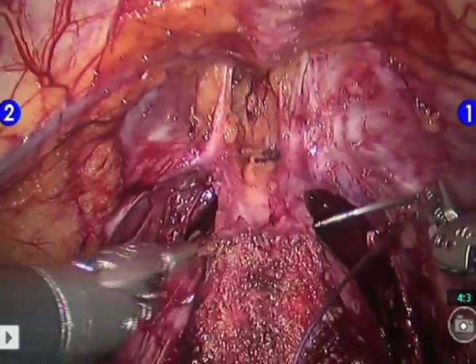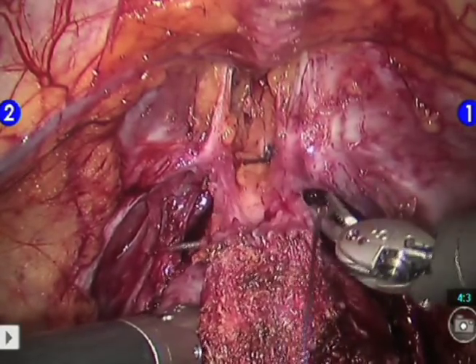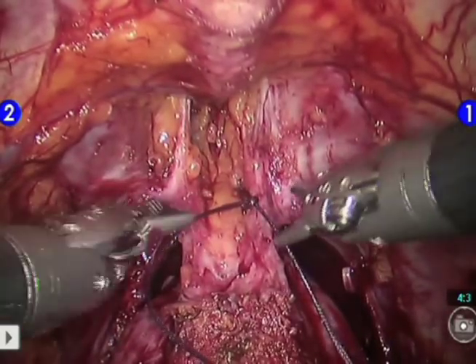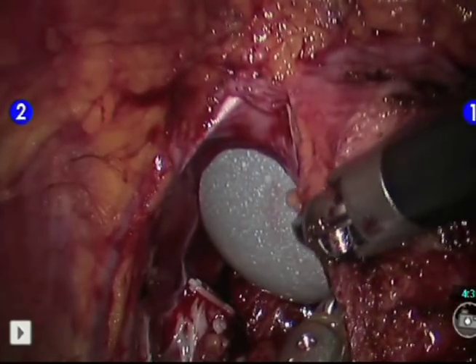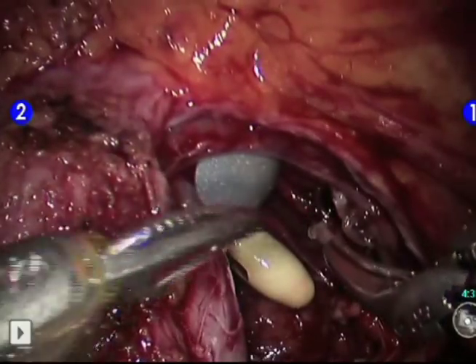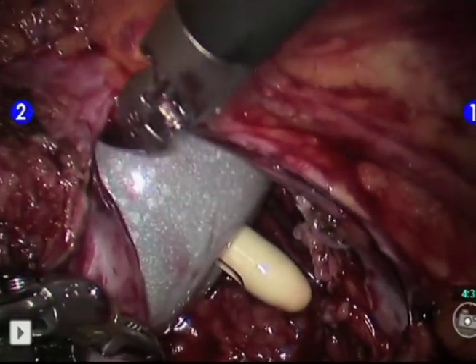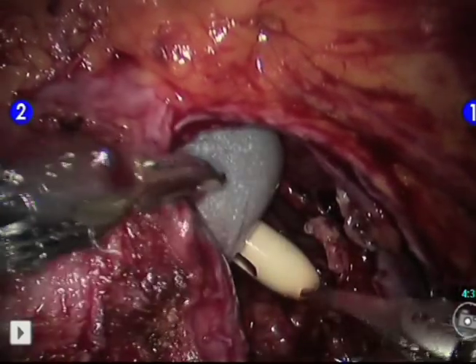Management of the DVC now depends on the width and thickness of the anterior tissue. If it is broad and thick, a DVC stitch with a CT1 needle and an 0-polyglactin suture is utilized, and the tissue is clenched using a slipknot. Alternatively, if the remaining tissue is thin, the pneumoperitoneum is increased and a Foley catheter balloon is inflated to 20-30 cc behind the prostate. The Foley is placed on traction, which partially occludes the DVC and opens up the space behind the prostate.